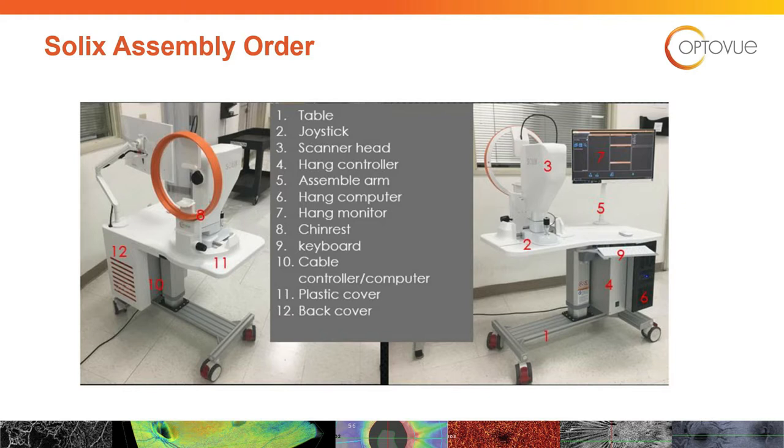Assemble the monitor arm and attach to the table, then hang the computer. Then hang the monitor. Assemble the chin rest. Place the keyboard and mouse, including the dongle for the mouse. Then cable the controller and computer. Attach the plastic cover over the joystick assembly and apply the back cover.